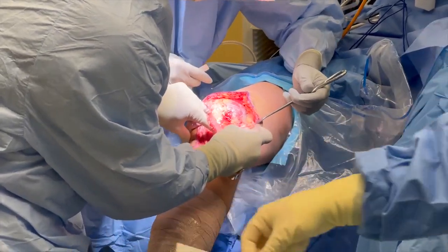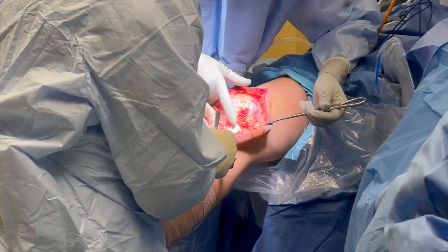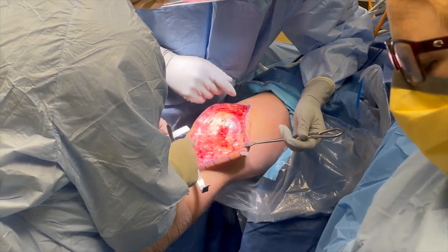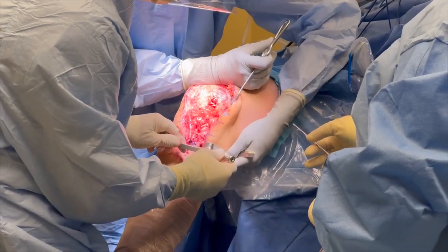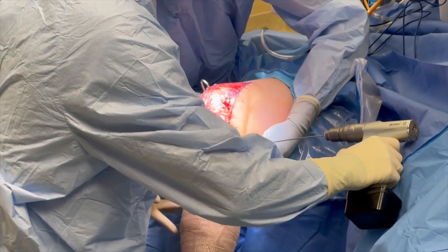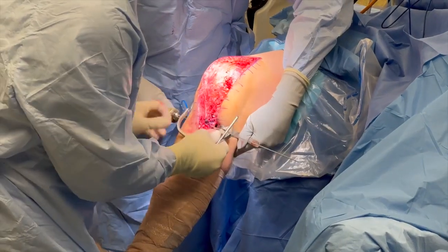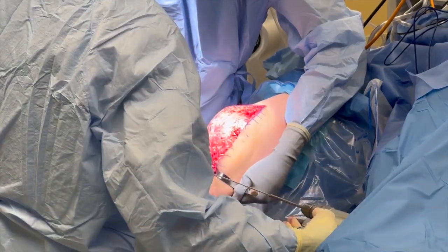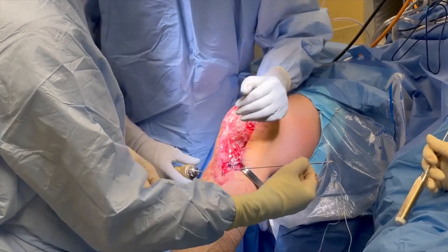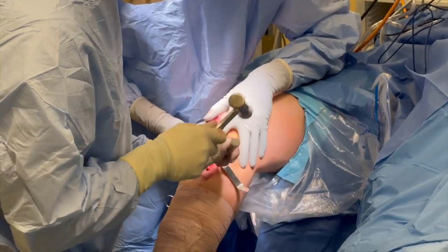A spinal needle is placed at the joint line, and the native distal tibial attachment of the MCL is located 6 cm distal to the joint line. This location is marked with a methylene blue marker, and a guide pin is drilled across the tibia using the collateral instrument tibial guide. This guide pin is overreamed with a 7 mm reamer to a depth of 25 mm, leaving the opposite tibial cortex intact. A passing stitch is placed, and the distal aspect of the tibial tunnel is notched.